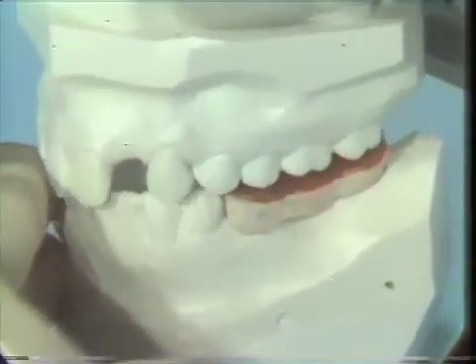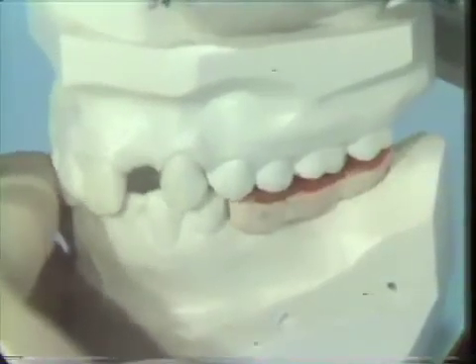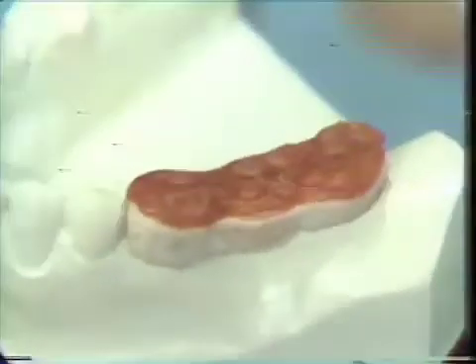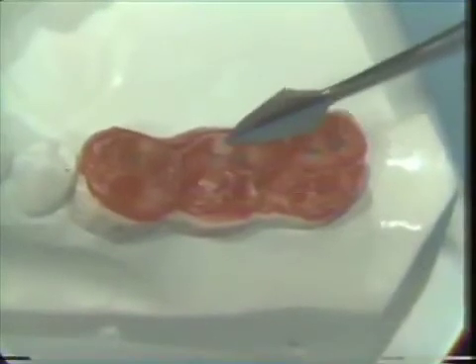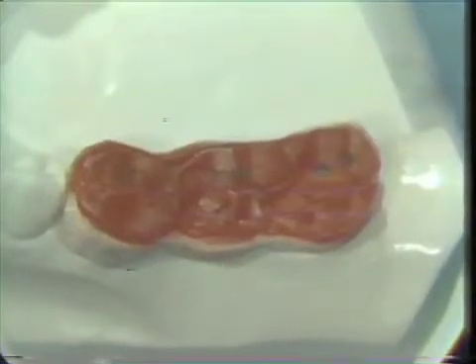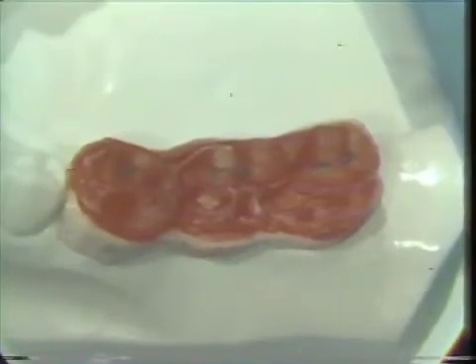We'll remove the upper member of this articulator. Remember that this was our patient, so that we can see our functionally generated registration a little clearer. And here you can see that we have registered the dynamic movements in the wax, and you can still see the indentations or the marks that we put on the platform prior to the time that we started, of the lingual cusps of the maxillary arch. We're now ready to prepare our tray and do our direct pickup in the mouth.